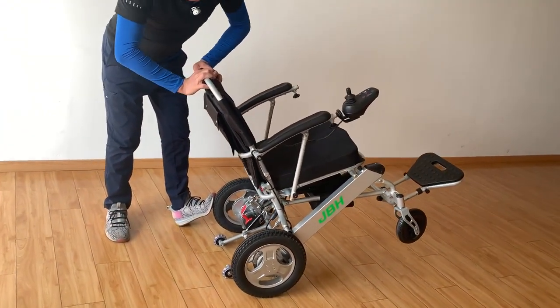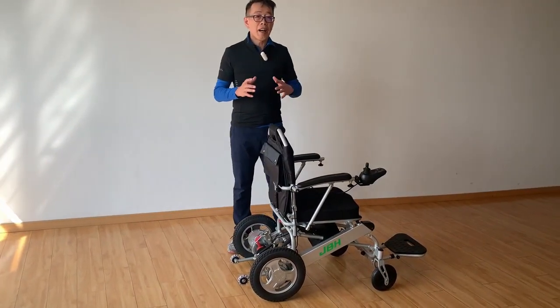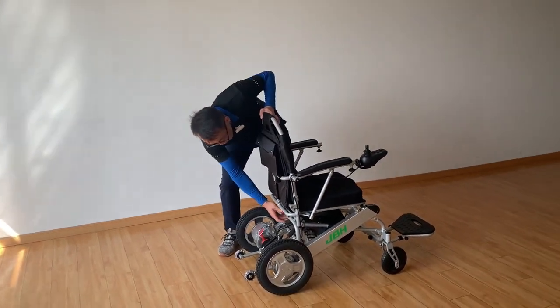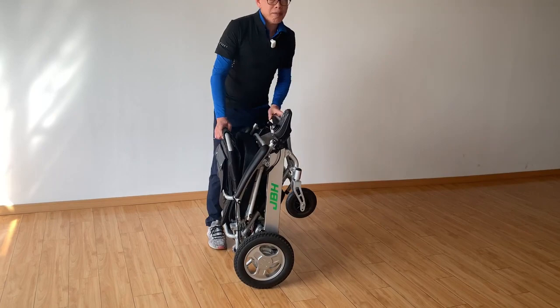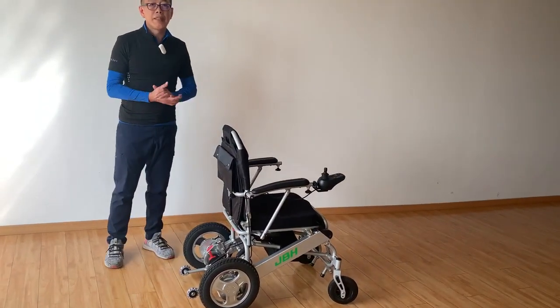Let me show you how easy, convenient, and quick we can fold the wheelchair. First, just touch the button here and push it down, then fold it — one second. Simply push it down, and that's it. Thank you very much.